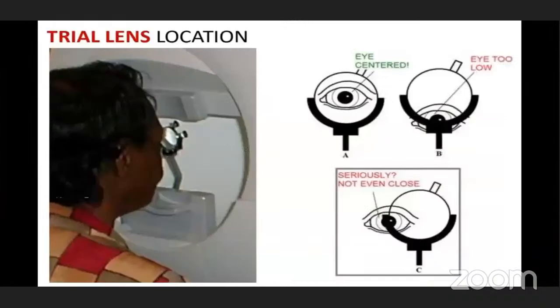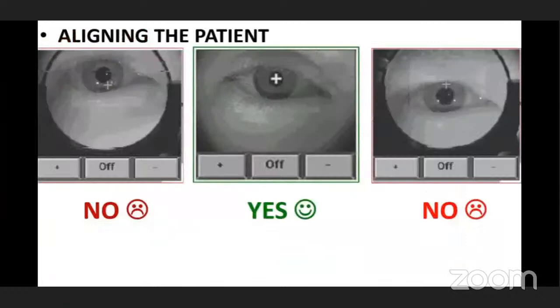Then we have trial lens placement. The lens should be centered properly — not too close — and the eye should be at the center and not too low. When aligning the patient, the plus sign should be centered with the pupil; it should not be up, down, or sidewards.